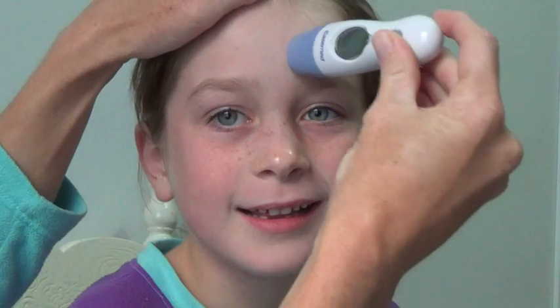I'm going to ask Alicia just a simple question to reassure all the children out there. Alicia, when I placed the thermometer in your ear, did it hurt at all? No, it tickled. And Alicia, when I placed the thermometer on your forehead, how did that feel? Good. And that didn't hurt either, did it? No. So there you go — there's just a bit of peace of mind for you and your children.